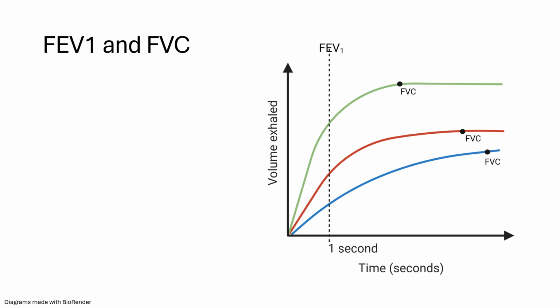And now do that blowing out your breath through one nostril. So you might be able to blow out the same volume of air both times, but the rate at which you do it is going to be very different. And this is what we're really interested in when we do pulmonary function tests. Breathing normally, you could probably exhale a pretty big volume of air in the first second of your exhale. But if you're breathing through one nostril, or even worse, like one of those little red cocktail straws that you're not really meant to drink out of, but if you're breathing through a very small tube, you would blow out considerably less air in that very first second.